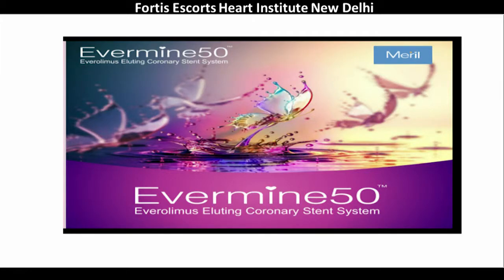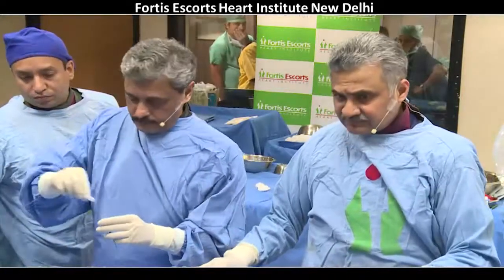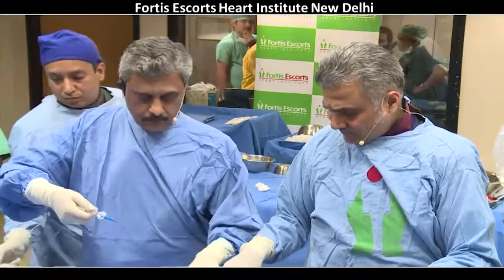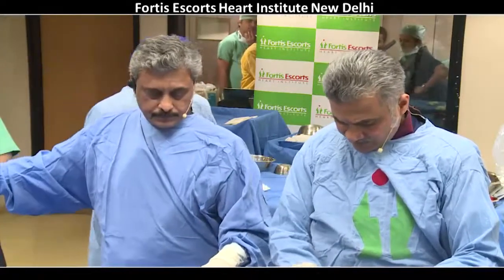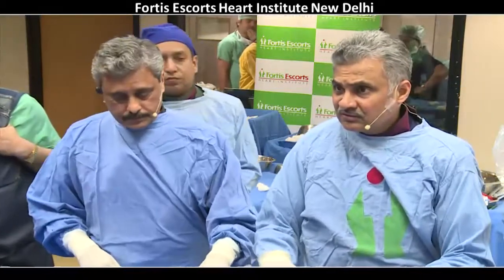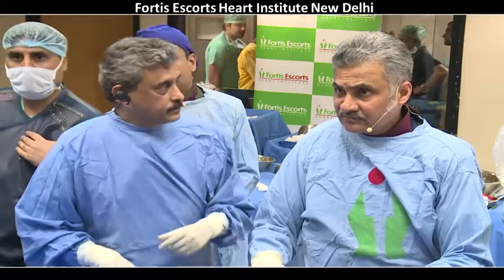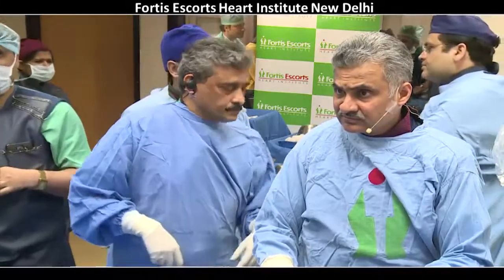Okay, so this is an Evermine, 50 micron, this time.